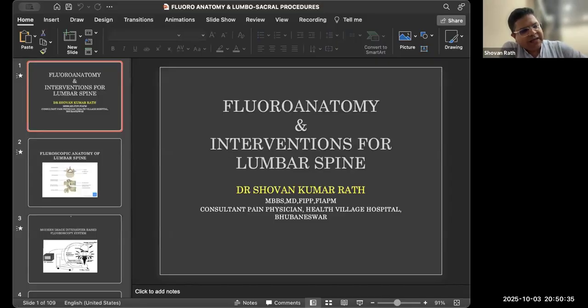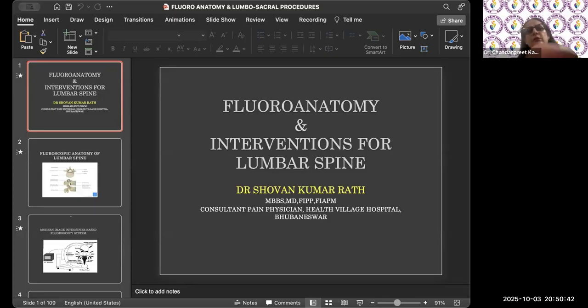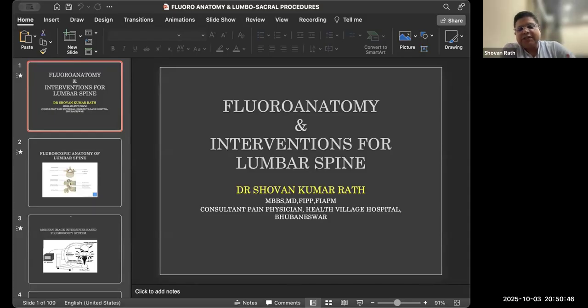That is why what we say is, whenever you are doing such kinds of procedures, your dye is the first thing which gets contaminated. Right. That is why whenever using a dye for multiple sessions, it must be properly kept, and you should not put multiple injections into that so that it is contaminated. And if you are using it inside the disc, the disc will be infected also. So that is what it is.